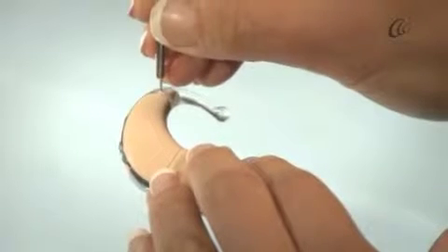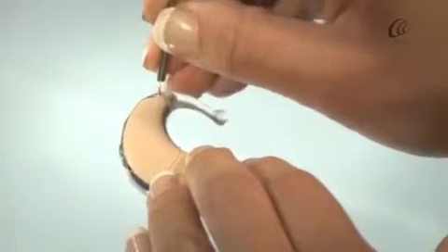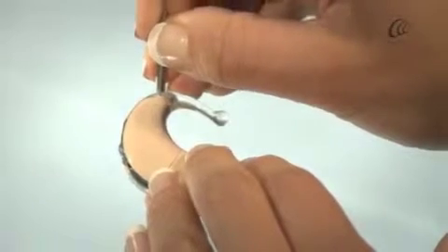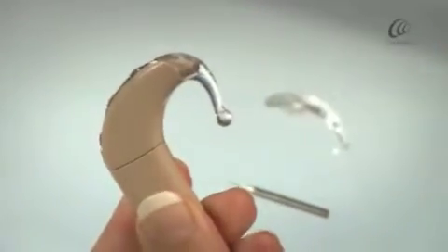Use the flat end of the earhook tool to fully insert the pin. The earhook is now locked to the sound processor.